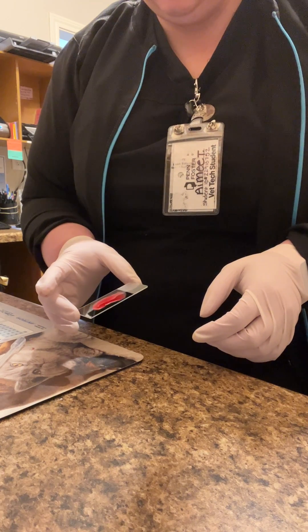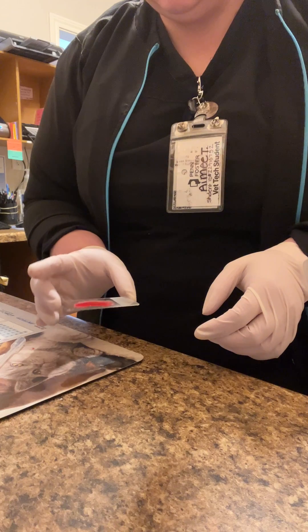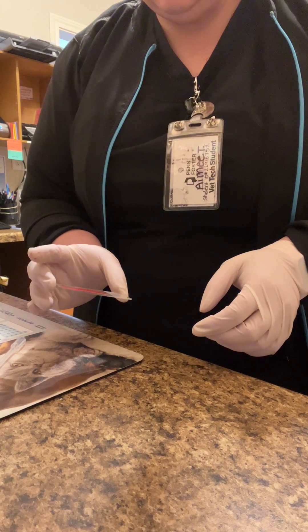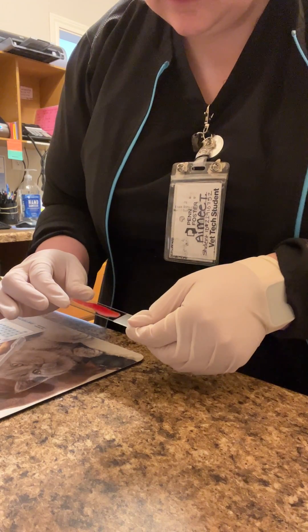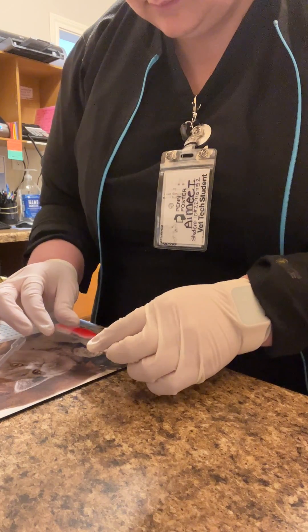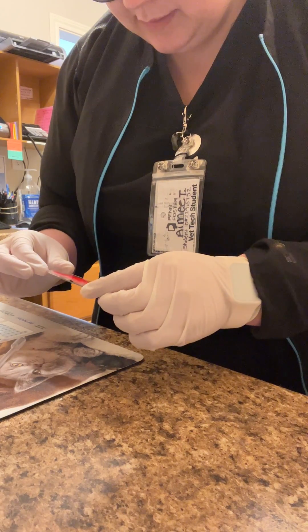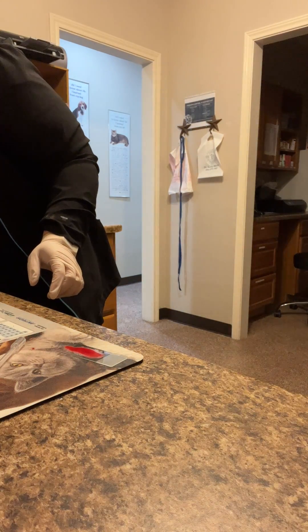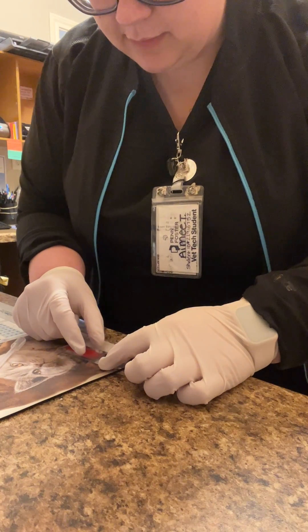To observe for macro-agglutination. And when I'm satisfied with my observation, get a clean coverslip and place directly onto the slide.